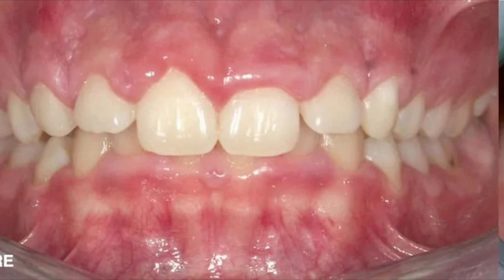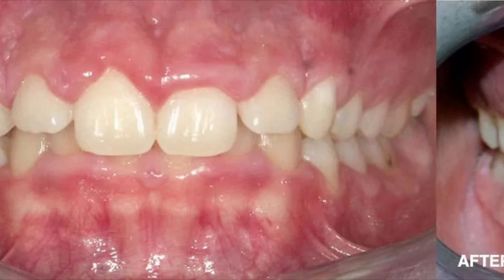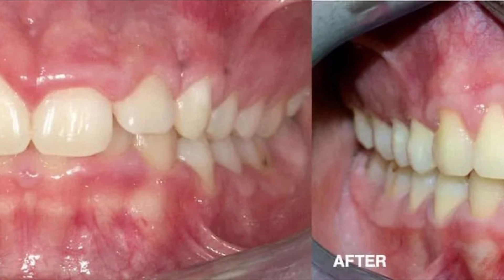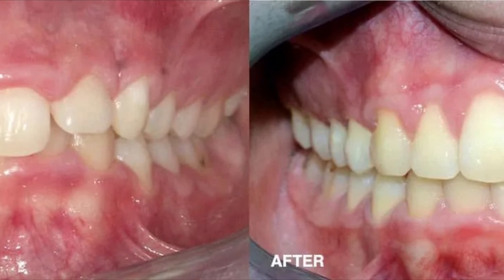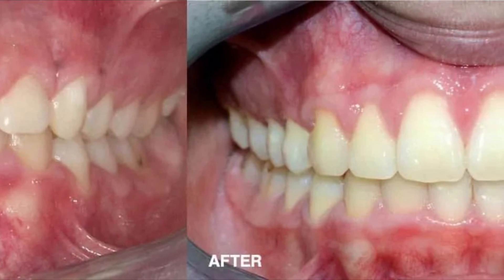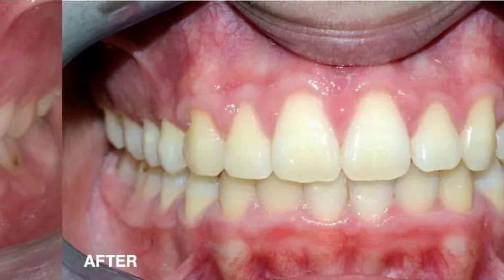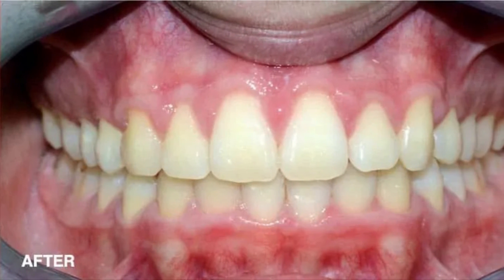In this case, you can see a patient with severely inflamed gums. These gums are cut back by the laser in a gingivectomy. This type of procedure normally requires a blade, but with a laser there's less trauma, less bleeding, less anesthesia, and the patient is much more comfortable while still achieving a great result.